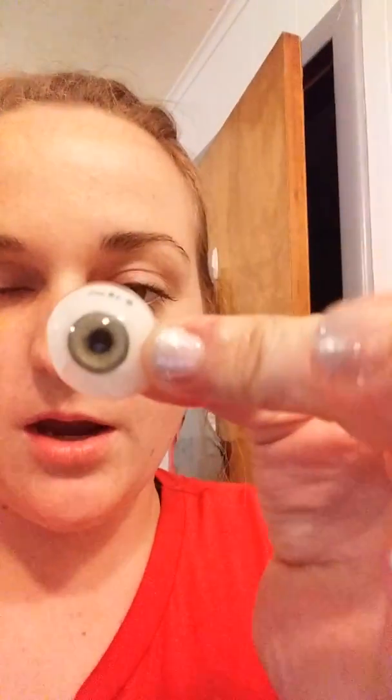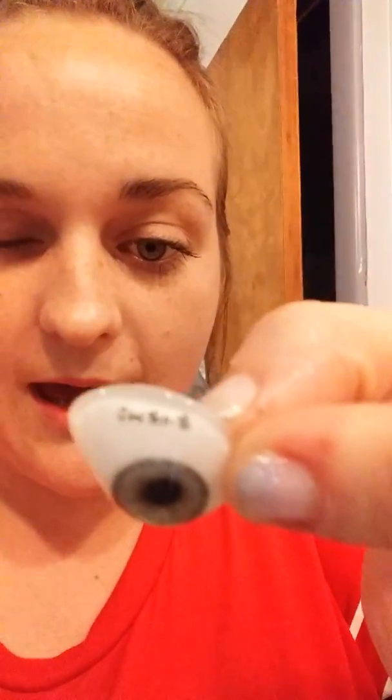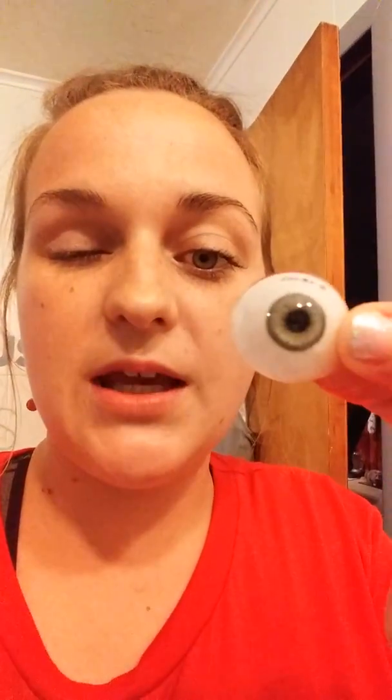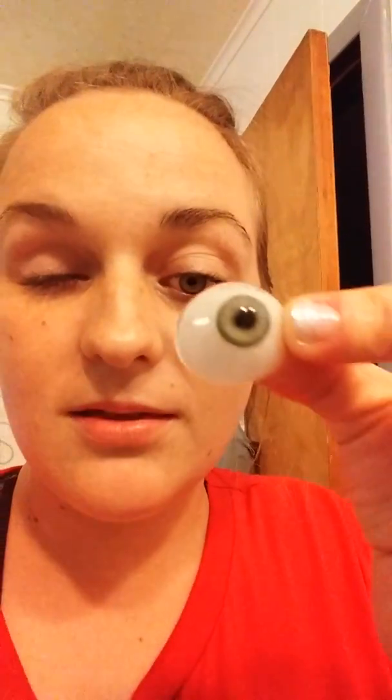Today: how do you know if your prosthesis has an infection? My artificial eye is out right here — same old eye. A lot of people do think this prosthesis is fake, but this is my real prosthesis eye.